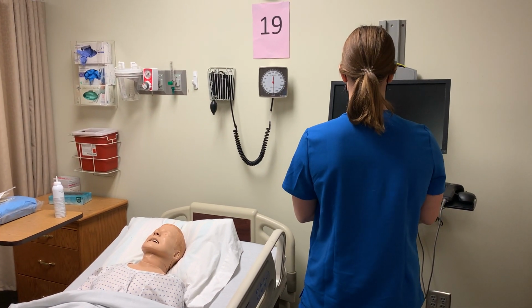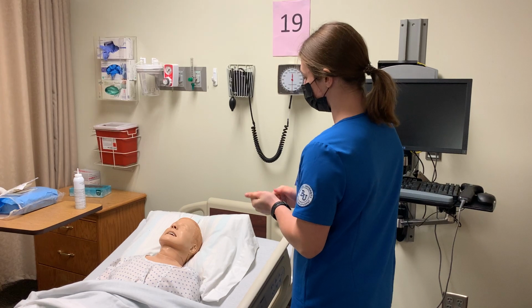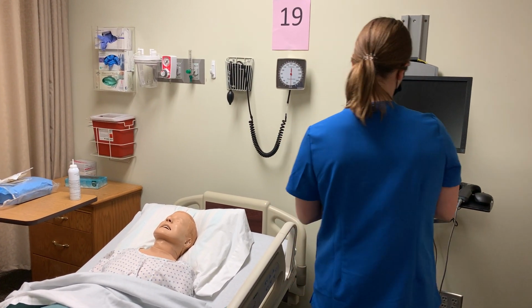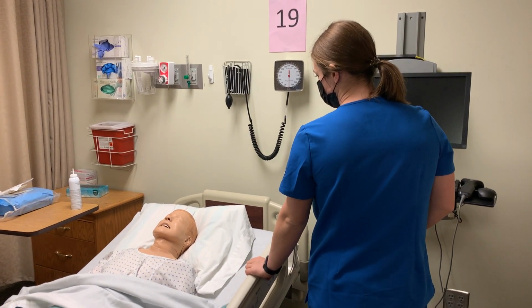So I'm just going to go ahead and verify that you do have an order to have a Foley catheter inserted today, and it looks like you don't have any mobility issues. Are you able to bend your knees and move your lower extremities okay? Yep. All right, perfect. So I'm going to go ahead and raise you up.